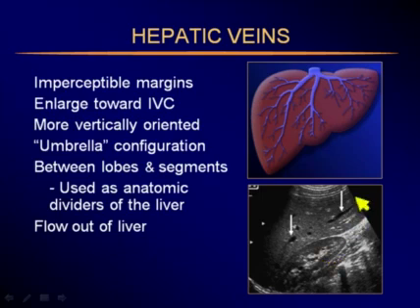Hepatic veins do not. And why is that? Well, it's a matter of contrast. The hepatic veins have imperceptible margins. They actually have walls, but we just don't see them.